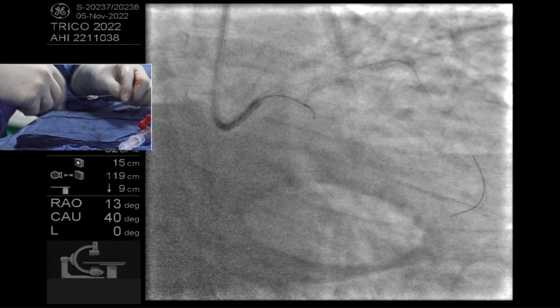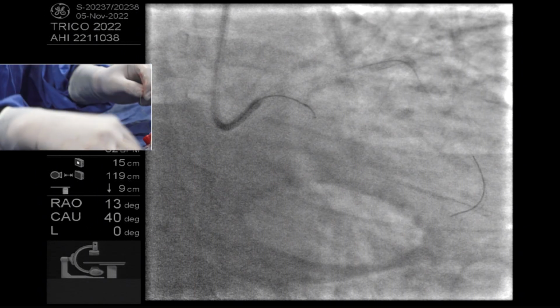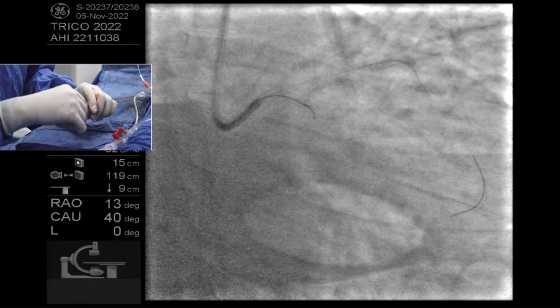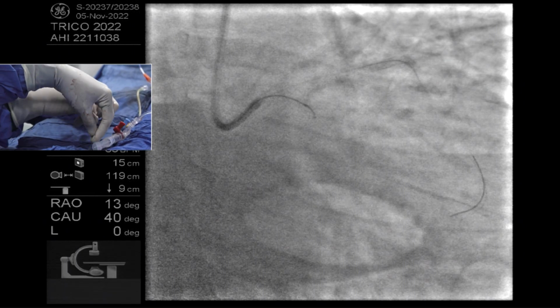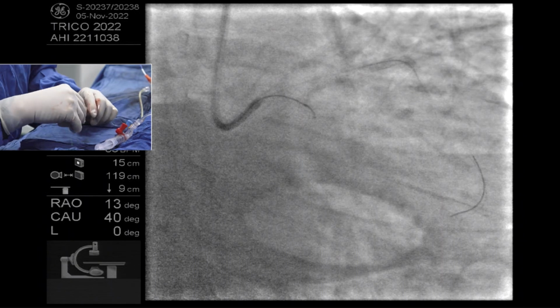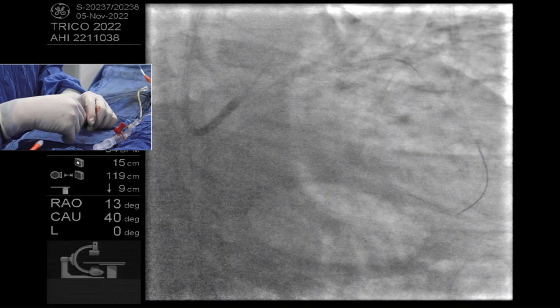And your directional microcatheter, like the Venture catheter, do you still use that, or do you prefer the SuperCross? Since the SuperCross came, we have not used the Venture much at all because of the profile. SuperCross is very successful for crossing into a side branch through a stent.